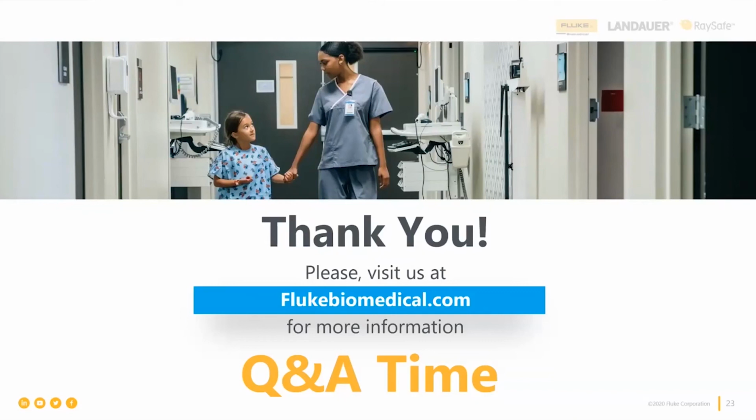All these environments that these AEDs can be in. They could be hauling around in the back of a cop car, bouncing down the road, in the center console of a fire truck. Is it in a personal vehicle? Is it in a section of the mall where it's been forgotten, overlooked? Is it in a high humidity environment? We're in Pennsylvania, and it's been about 93% humidity for the last month. Or you're down in some of the southern states where it's super hot and humid. All those have effects on the electronics on the inside. You're asking an awful lot of that internal microchip to trust that it's going to catch all those nuances that you would probably catch by actually running it through its paces.